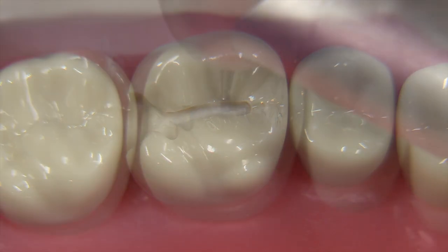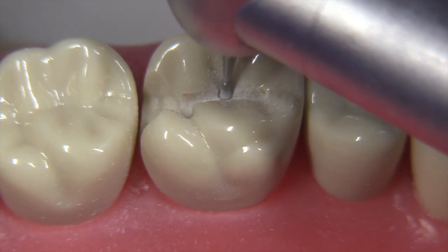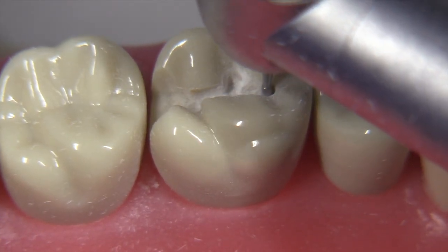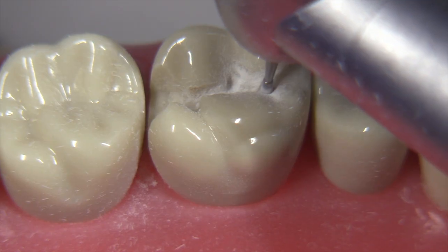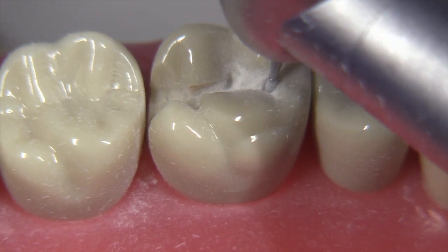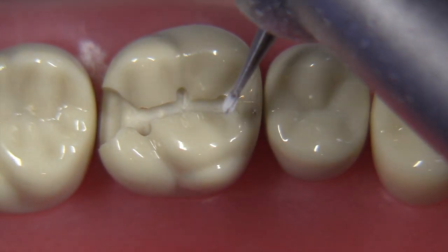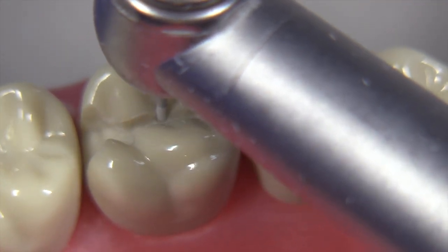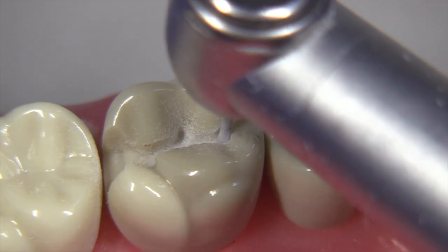At this point we're ready to do further extension up into the facial primary groove, and also extend that mesial into a dovetail shape. You probably wouldn't need to make this dovetail shape purely for retention, but it tends to be a very common shape because there are usually some pretty affected and perhaps infected secondary grooves which will create a little bit more of that shape. It's also a stylized classic design that graders would be appreciative of on a bench test.